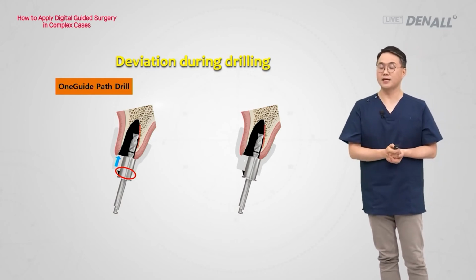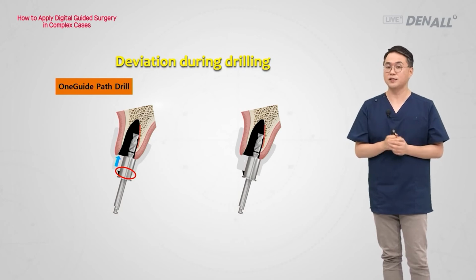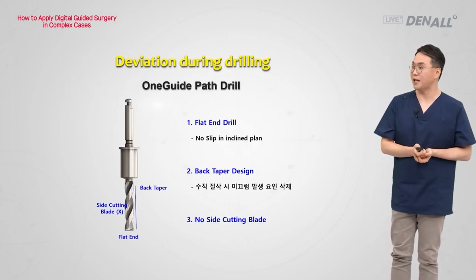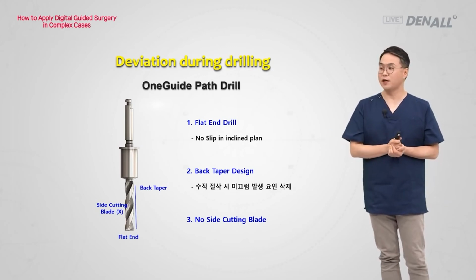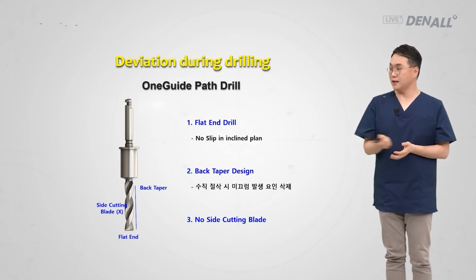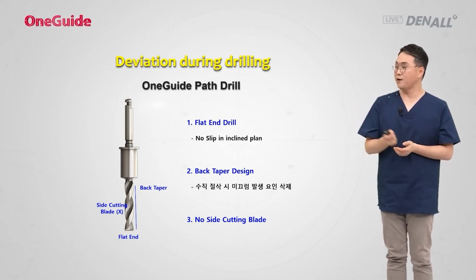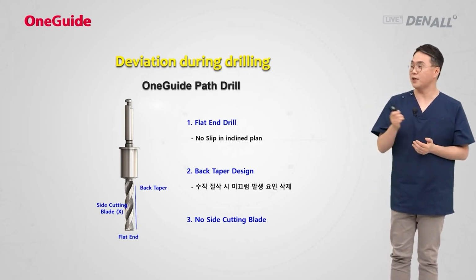After that, the OneGuide drill or initial drill can be tried. As the palatal interference is removed, you can advance the drill easily. The end is flat. It looks like a dedicated cutting drill. When the end makes contact, strong cutting can be made and is designed to make a lattice shape.